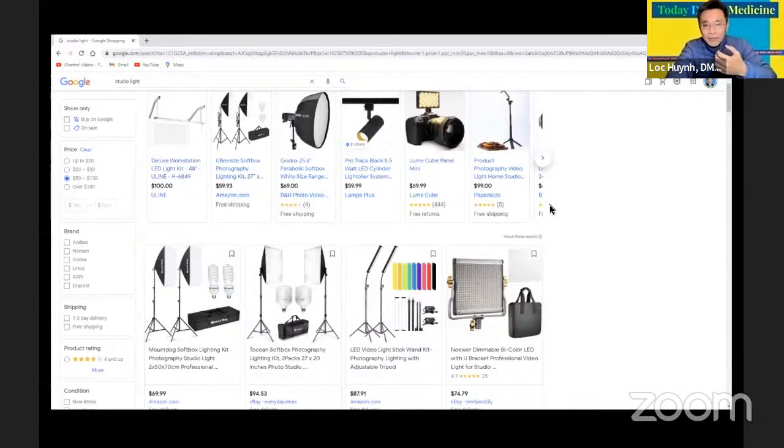Another photo, where I turned around and took the picture. It's the same room, but a different appreciation of the depth and how the photo looks. My reason for sending these pictures is just to let you know that when you take a photo, there is an art involved. If you Google online, you can find a bunch of lights like this that are very affordable, less than $100, that light up your patient's face and teeth and give a brighter smile.